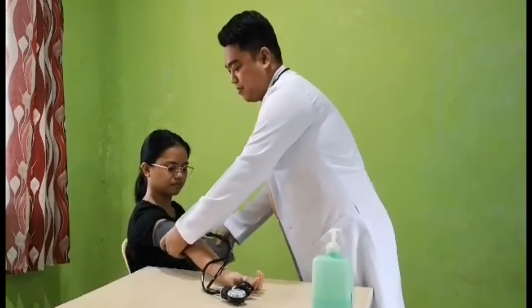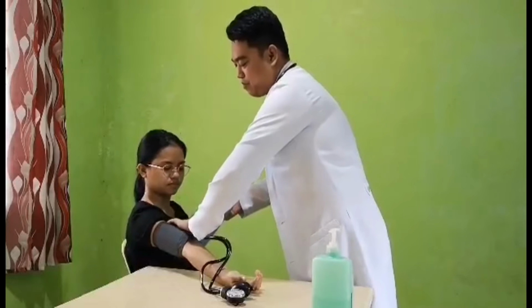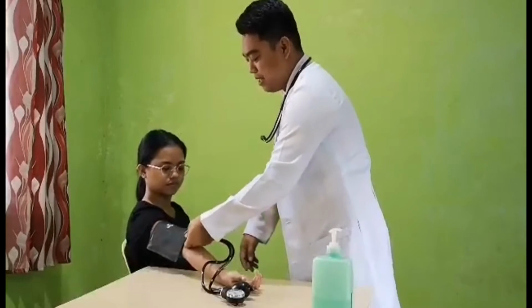Make sure that the cuff is properly fitted over the arm of your patient. Make sure that it's not too loose and not too tight. If your cuff is too loose or too tight, you might get abnormal BP readings.